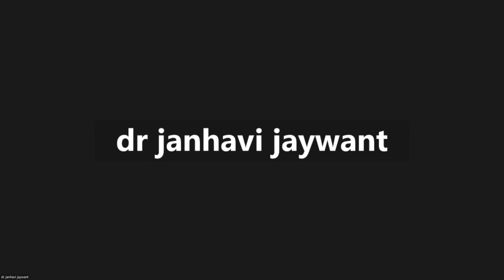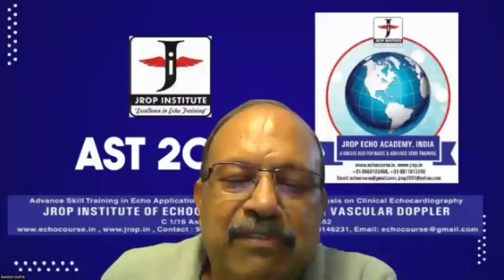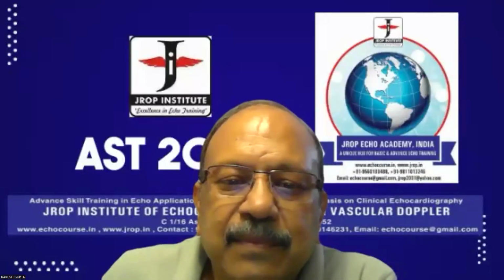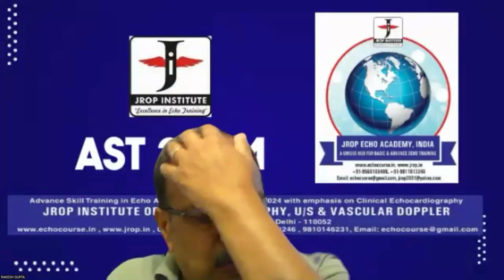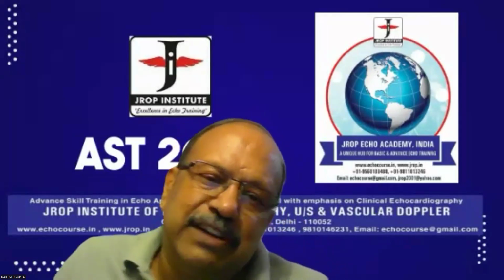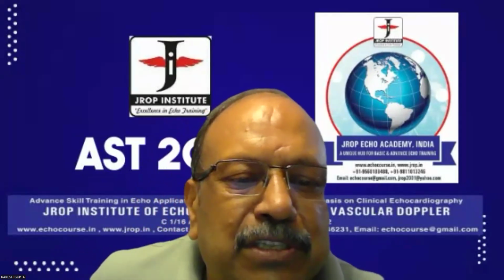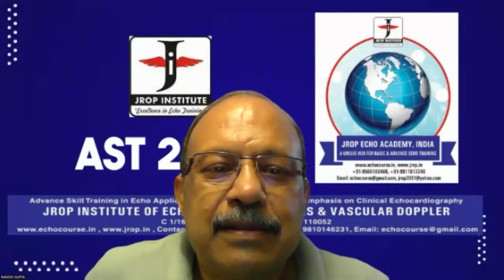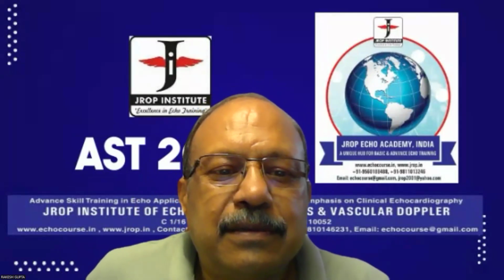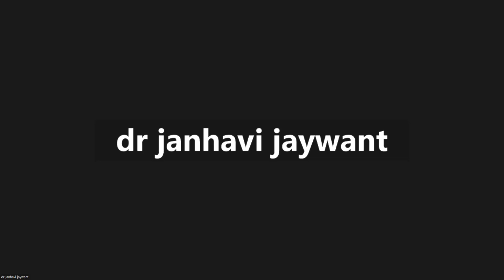Sir, in case of AF, it will be varying, no, sir? Mitral VTI will be varying? Yes, mitral VTI would definitely vary with every atrial fibrillation patient, no doubt about it. So we have to average it?